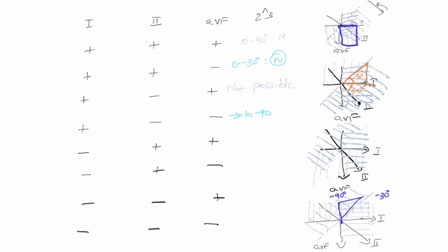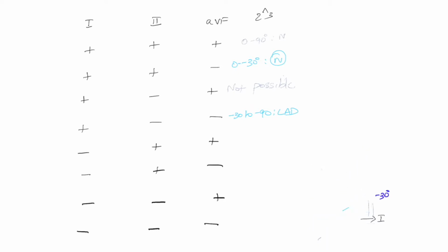And when the axis falls in this area, this would be considered left axis deviation. So let me go ahead and erase these pictures and make some space, and we'll resume. So let's go ahead and draw our vectors again. So you have lead 1, lead 2, and AVF.